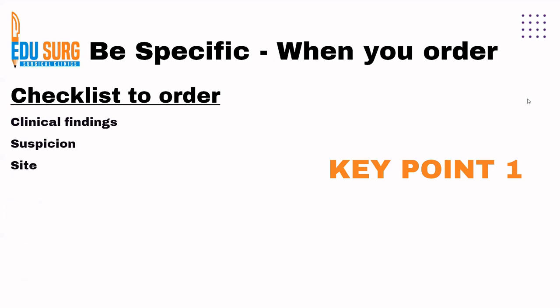Site. So if you are thinking of rectum, we advise MRI. If you are thinking of colon, a CT is preferred. If you are thinking of a gallbladder pathology or a liver pathology, there are site-specific changes in the scan that the radiologist needs to do.